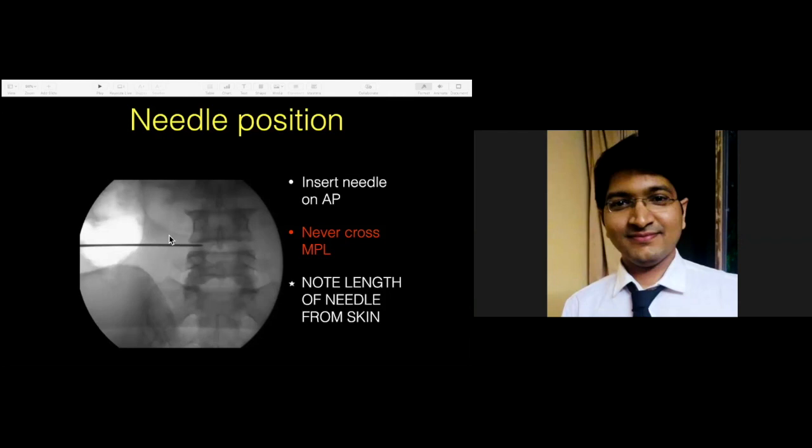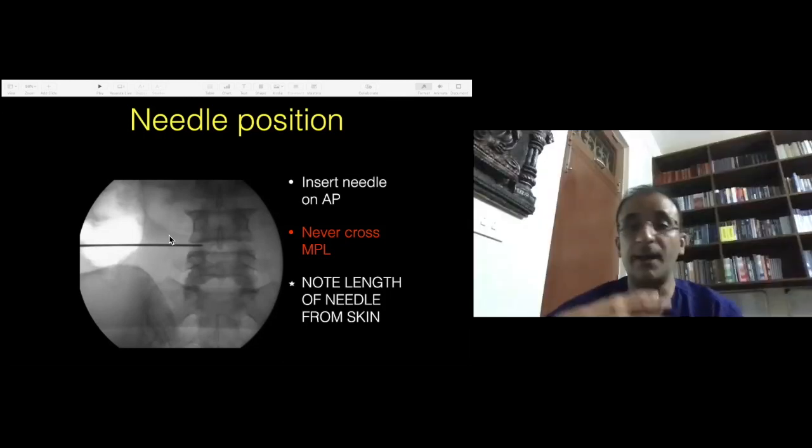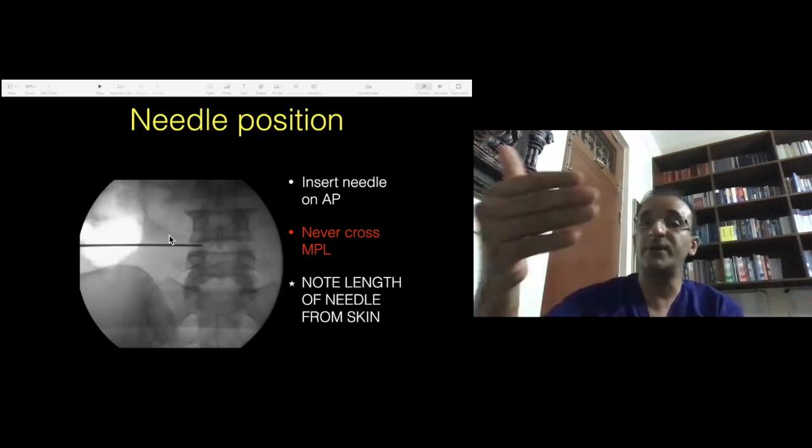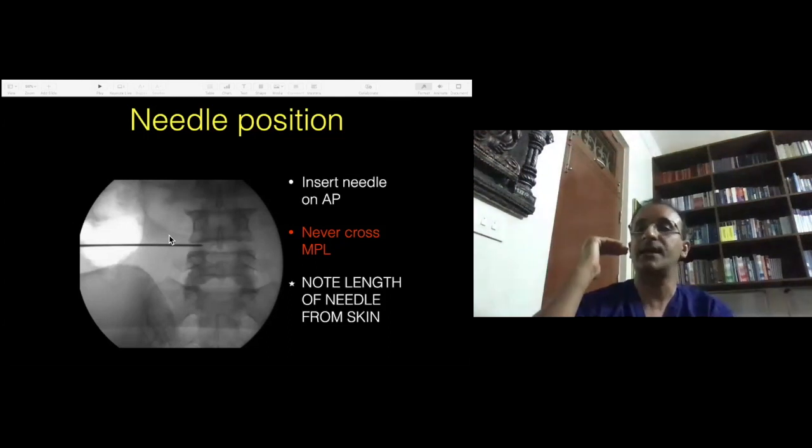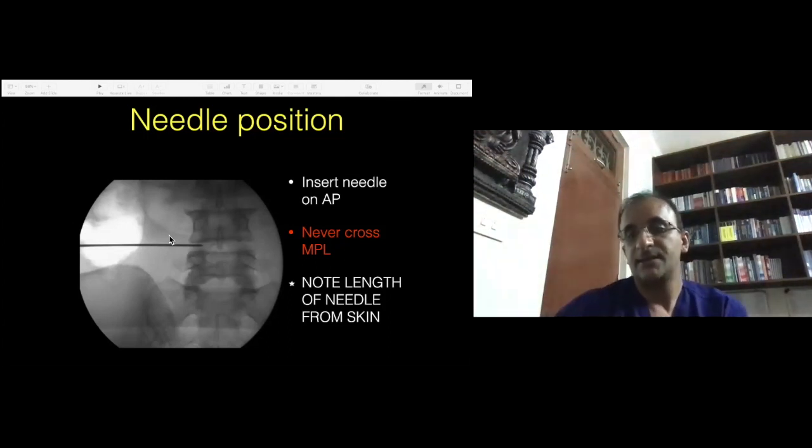Means end plate is parallel. You are asking end plate is parallel to your needle? No, not parallel to my needle. Parallel view. You are absolutely end on with the end plate. So everybody, please try and understand. I'll give you the answer, Ninad.